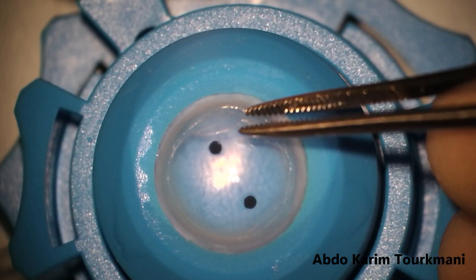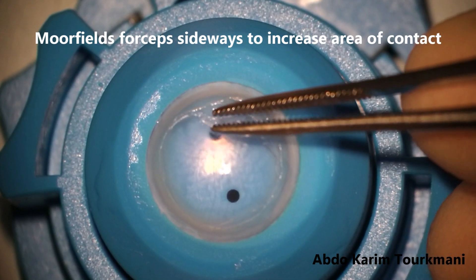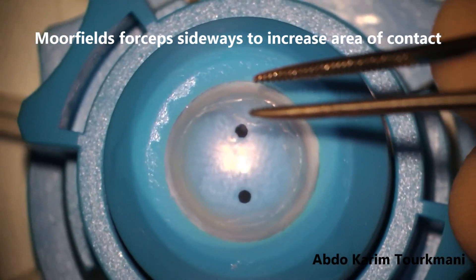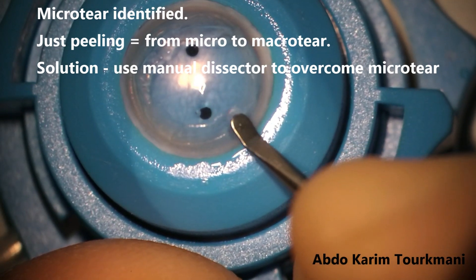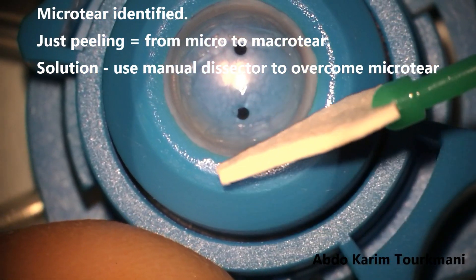Every now and then I would moist the tissue, put it back, explore for micro tears in the periphery, and then continue doing the same over and over again. Please notice that I am putting the Moorfields forceps sideways, so the area of contact is even bigger. At this point I have identified a micro tear, so if I just insist on grabbing and pulling, I will just make the micro tear bigger.